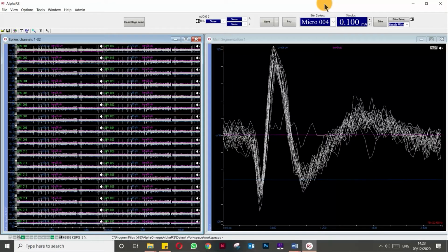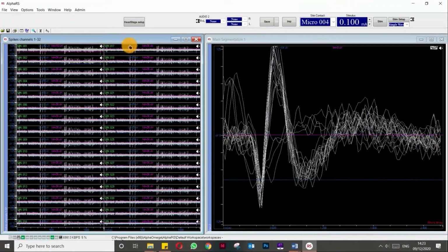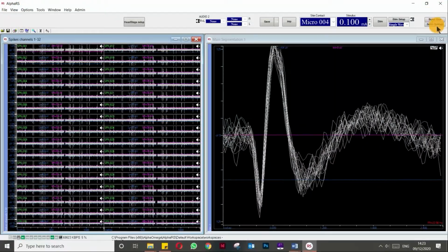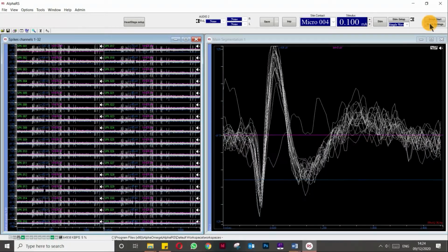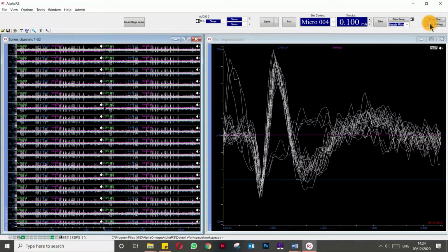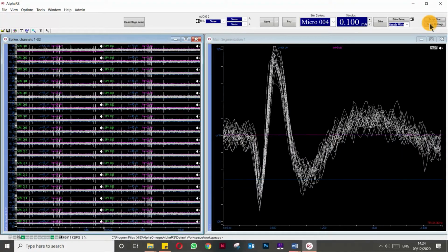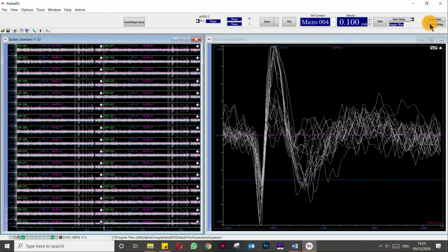For automated stimulation, a script can be configured to perform a customized stimulation setup and form. And this is done by showing the script and uploading the settings over here. Now, a script can also be used to control system features such as digital input, digital output, and stimulation, and can also be used to trigger the stimulation and digital output from specific data.